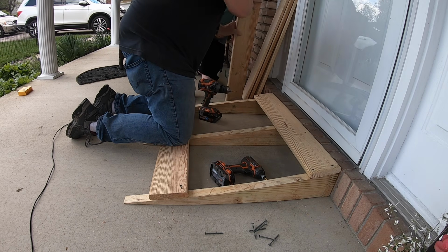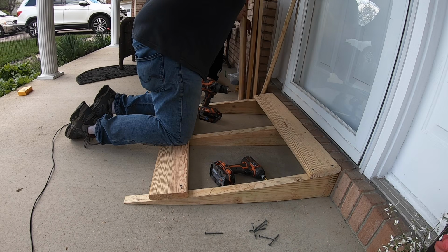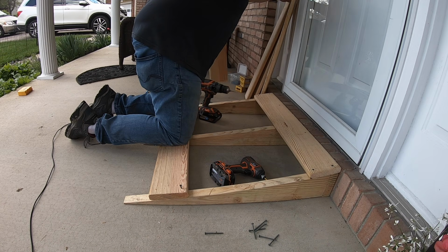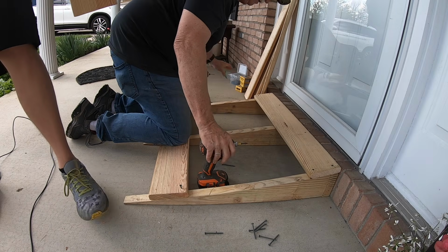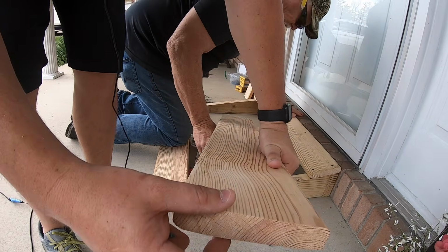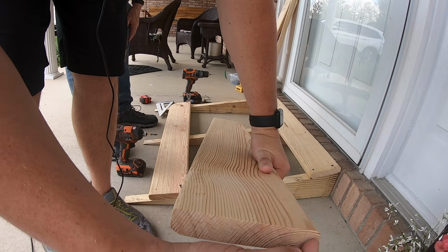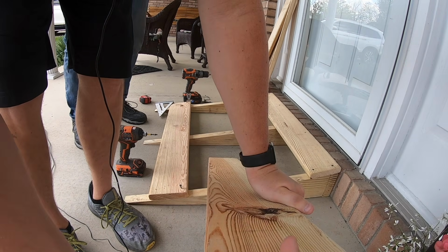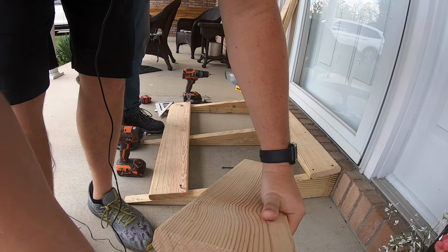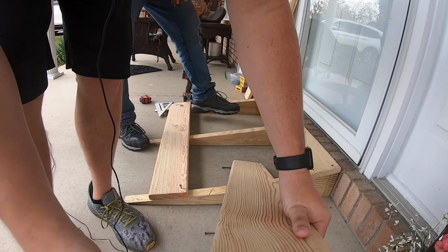Now, do you want to tell them what it means to put the cups down by looking at the grain? Yeah. Use it as a reference with like a frown or a smile. Yeah. You want a frown, not a smile. One other quick thing, you want the cupping to frown, so if the water does come, it does not puddle up and go down into the grain. And so this is the direction you want this down.